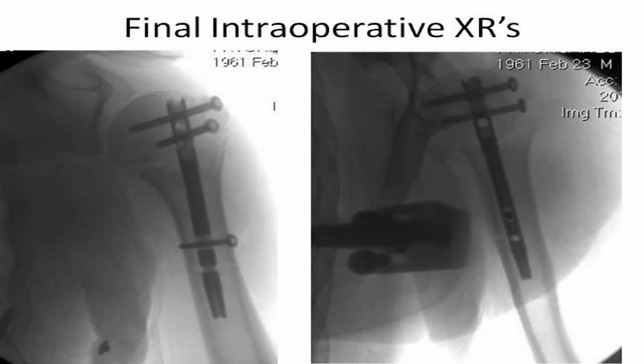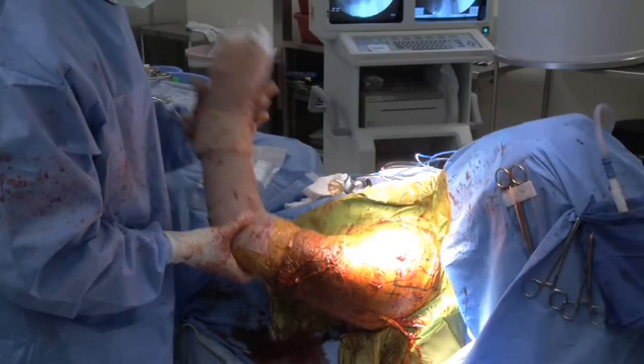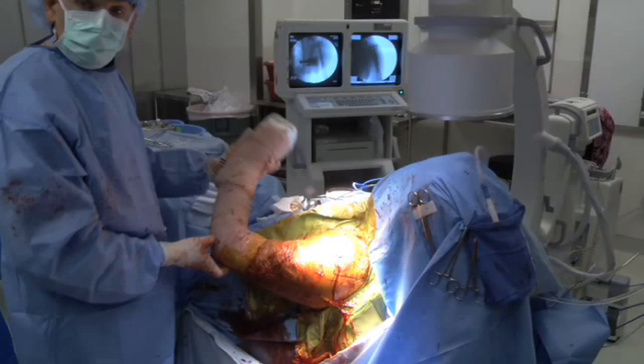The deltoid and coracoacromial ligament are sutured back to the acromion using transosseous absorbable or non-absorbable sutures according to the surgeon's discretion. The final intraoperative range of motion can be assessed before or after closure while the C-arm is present if desired. In this case, the intraoperative range of motion was near full with some limitation of elevation secondary to the drapes. This range of motion assessment can guide limits for passive range of motion exercises, which are usually started immediately postoperatively.